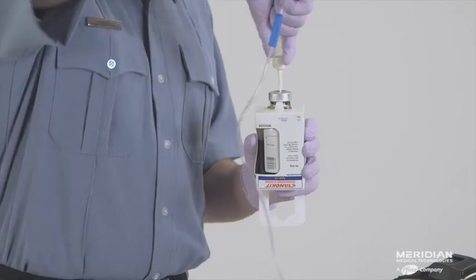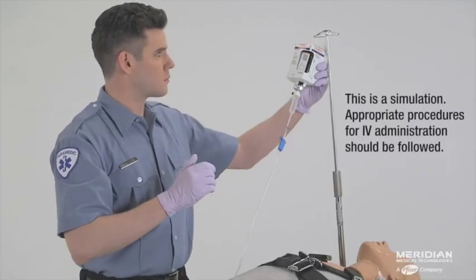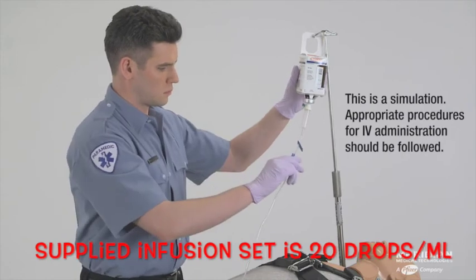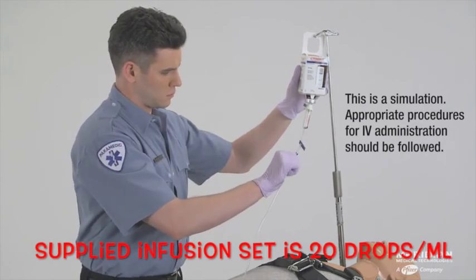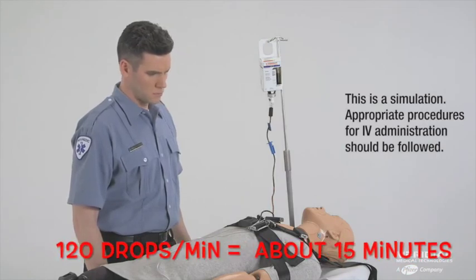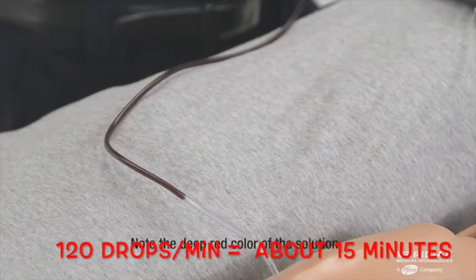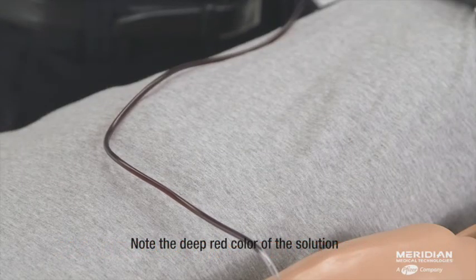The solution is now ready to be infused. Using the supplied vented intravenous tubing, hang and infuse over 15 minutes. Because there are a number of drugs and blood products that are incompatible with Cyanokit, it requires a separate intravenous line for administration.